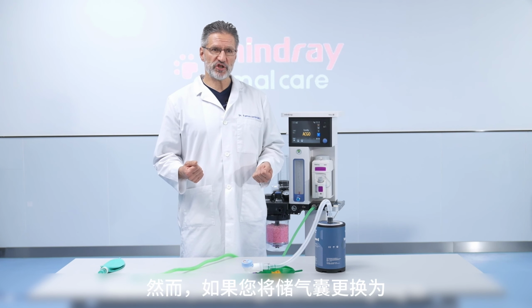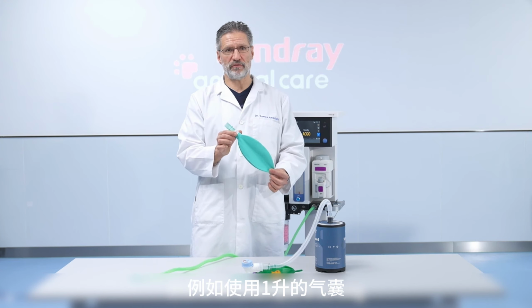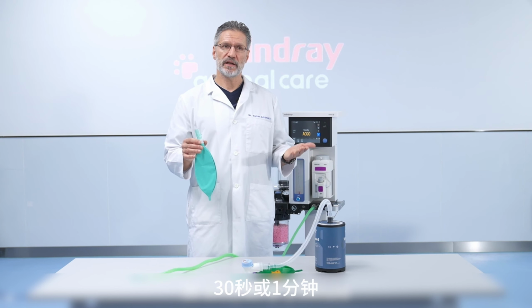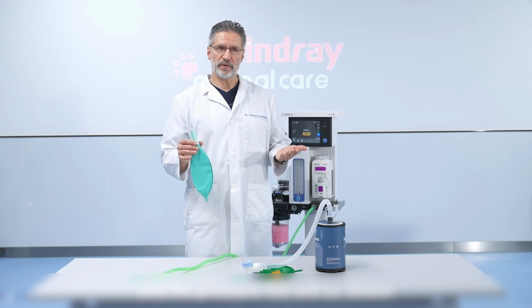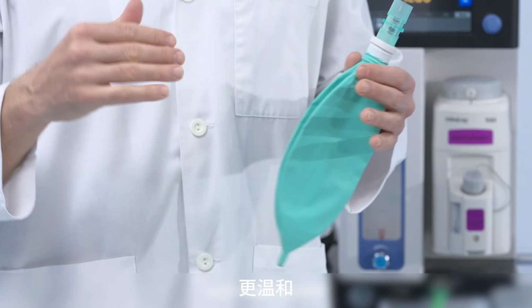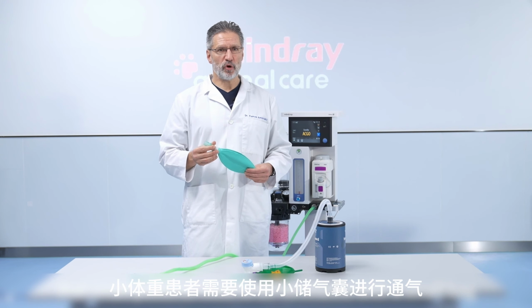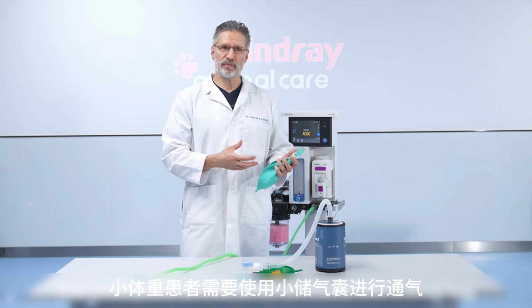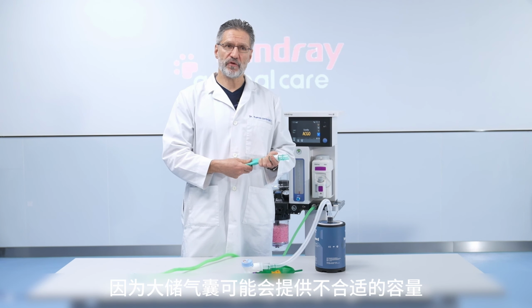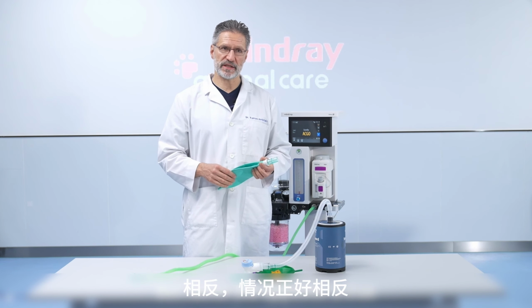However, if you change the breathing bag to a 1 or 2-liter bag, this is for example a 1-liter bag, these 15 seconds will increase to 30 seconds or 1 minute. And the pressure rise will be slower and more gentle, hence safety is improved. There is an argument that small patients need to be ventilated with a small bag because a large bag would deliver inappropriately large volumes. In my opinion, it's not true, but rather the opposite is true.